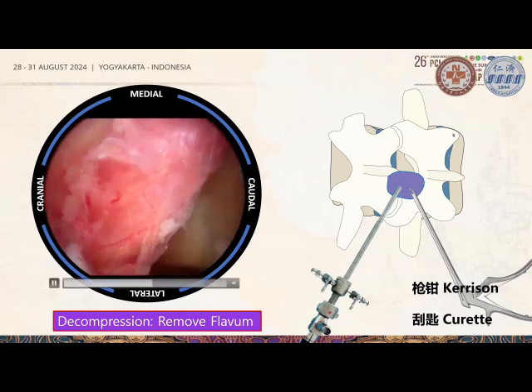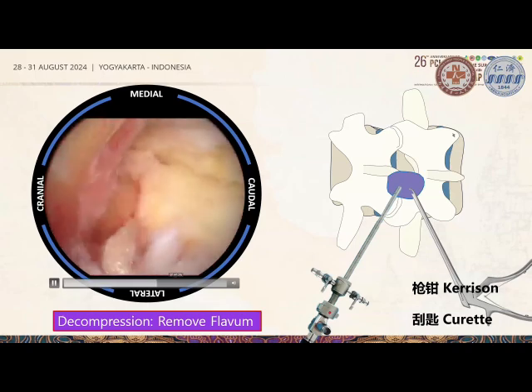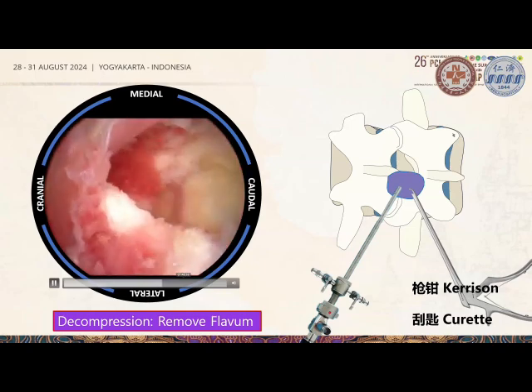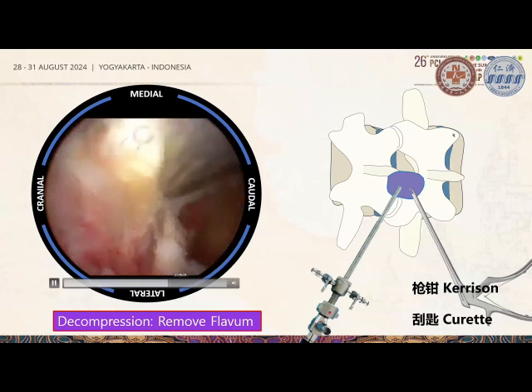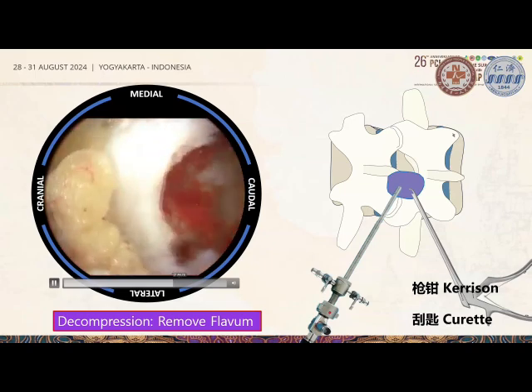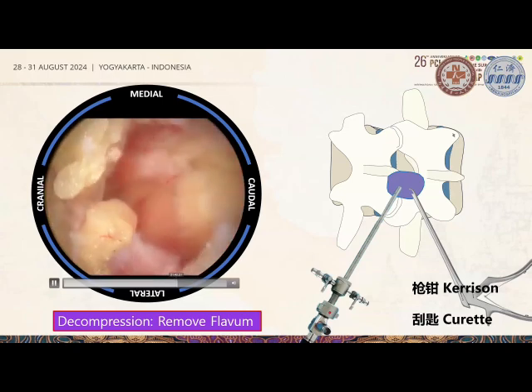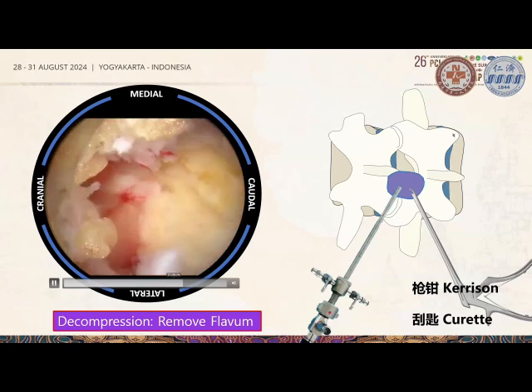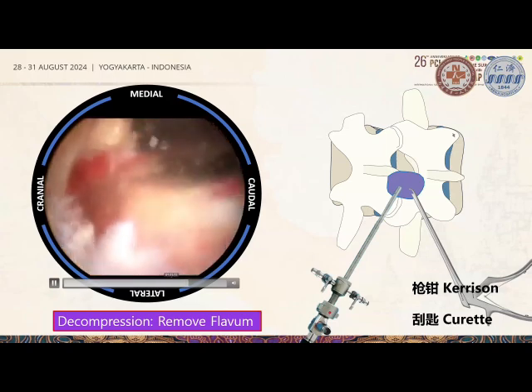Removing the ligamentum flavum can take some time but it can be done gradually in real time. Sometimes muscles creep in from above, so we get underneath and remove them accordingly. After removing the facet joint, we assess whether there is sufficient space for cage insertion; if not, we enlarge it further using a Kerrison or drill.